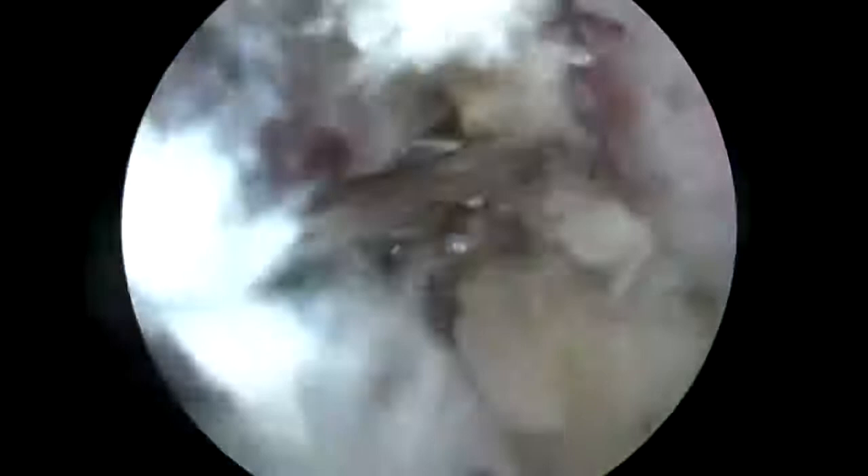This is an electric device. Now I use biters. I just cut the capsule 360 degrees around the shoulder. This is an arthroscopic outpatient procedure.